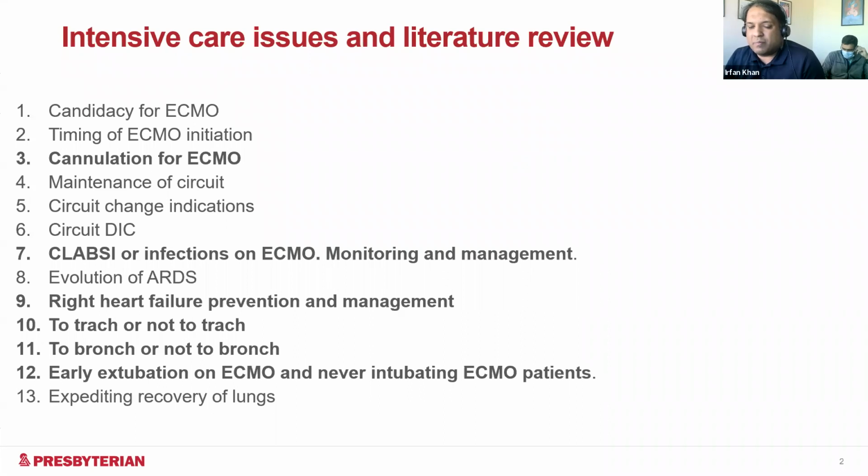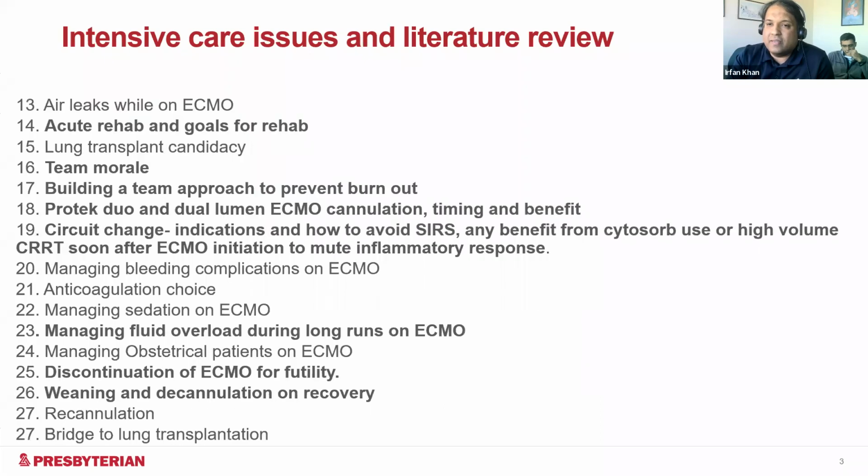The other thing that has come up lately is early extubation on ECMO. Basically, the patient is allowed to be on nasal cannula, high flow nasal cannula, and never intubated at all. That's one thing that is being offered at some centers. And then again, expediting recovery: can we make any difference in the recovery of the lungs? Can we expedite it? That's a question that we need to ask.